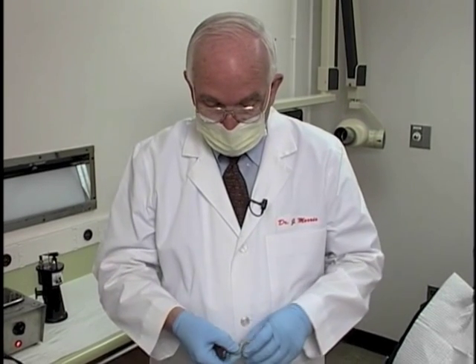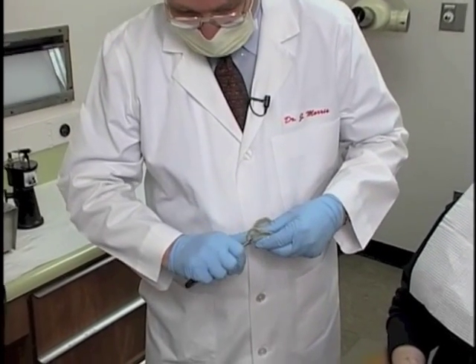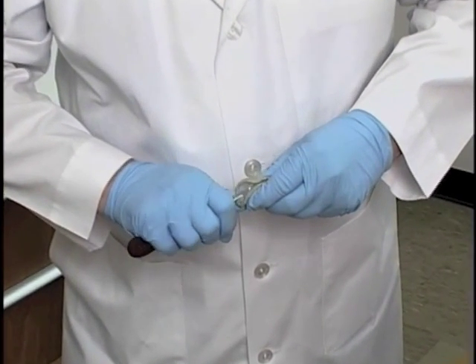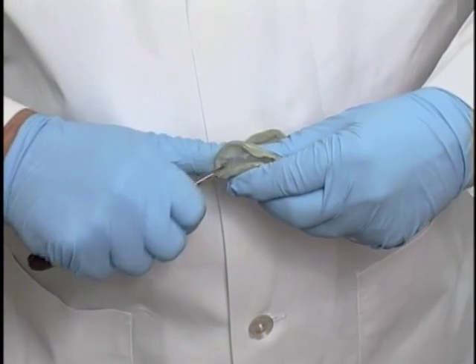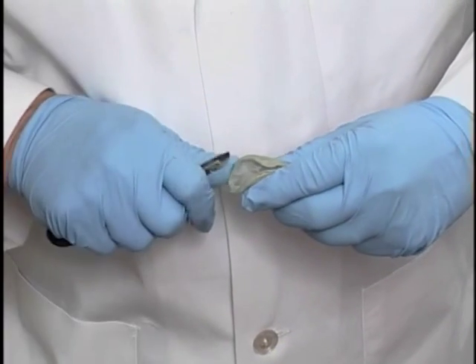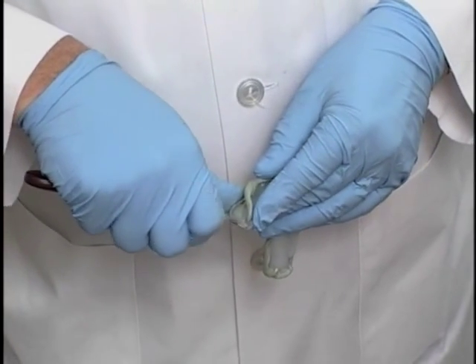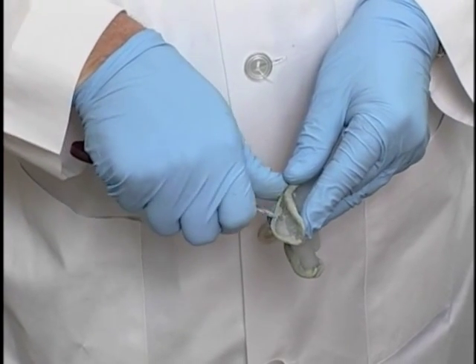So we're just going to trim that with a good sharp knife. You need to make sure that you trim it back off that retromolar pad enough that when you make the impression, that retromolar pad is not distorted by your tray or the compound.